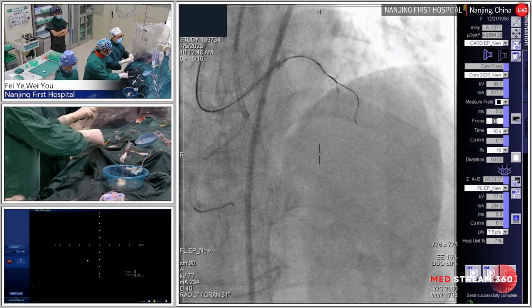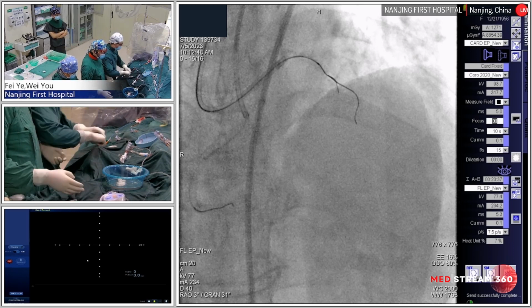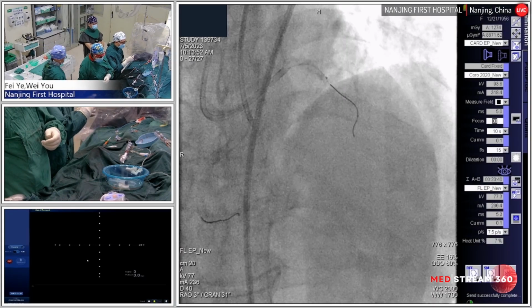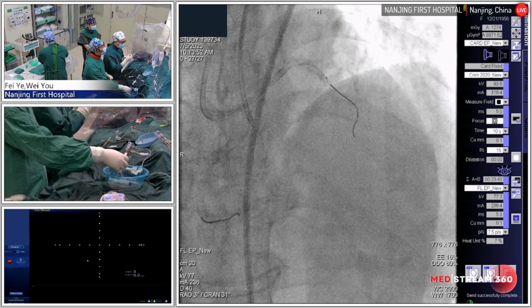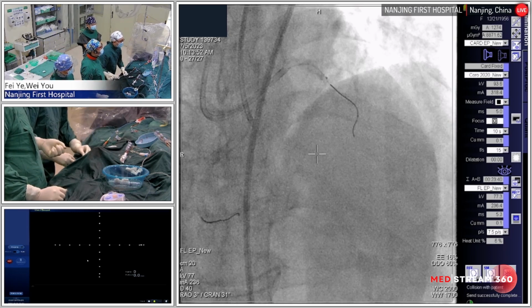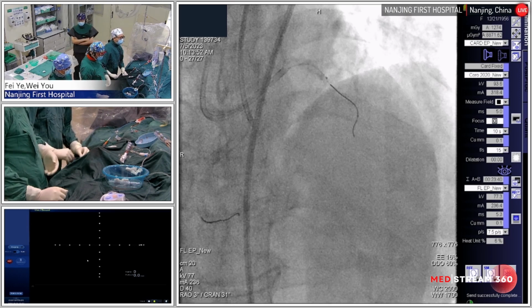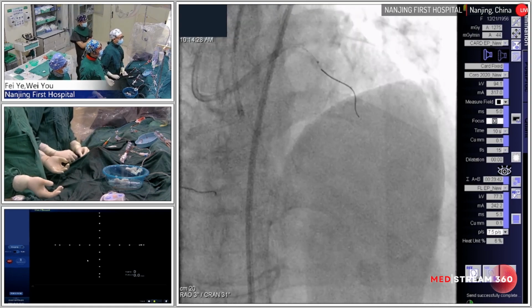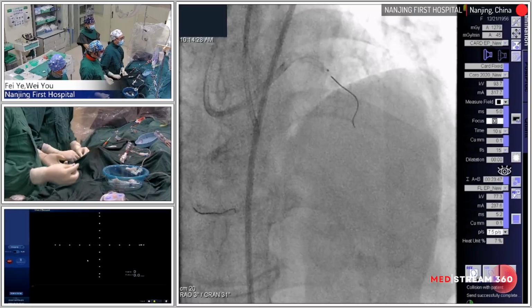I don't want to escalate the wire tip because the first guidewire went, I think, smoothly, just because the second wire is not in the previous channel. But I think it's very difficult to perform parallel wiring because of the very tight lesion; I feel the wire is bitten by the proximal segment. Even with the double lumen catheter, when I tried to insert and retrieve, the wire just could not keep its place. So that's why I changed to the single catheter. If I fail, maybe I will try the double lumen catheter to perform parallel wiring again.